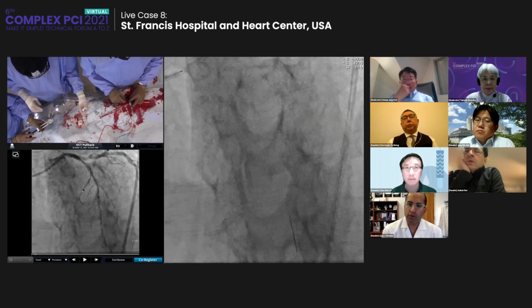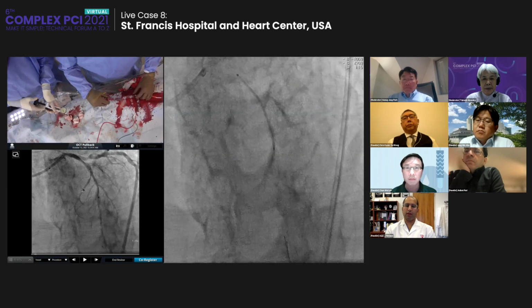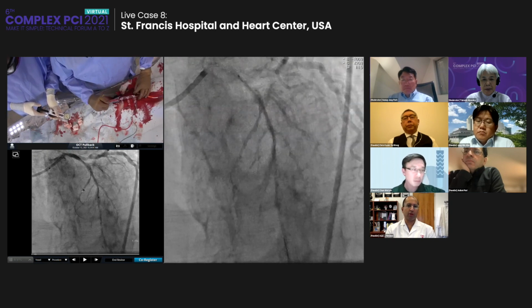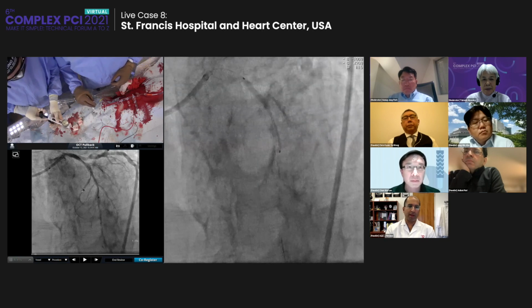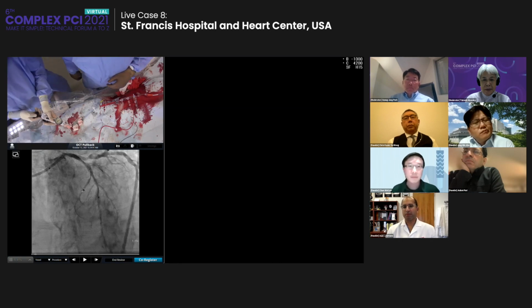Maybe Z or Rich, you want to talk a little bit about what happens if inadvertently you don't get the vessel and you deploy the stent, you have an underexpanded area. There's some question of whether you should use Shockwave acutely in a fresh stent versus not. We've done that. Better than leaving an underexpanded stent, but what are your thoughts on that?